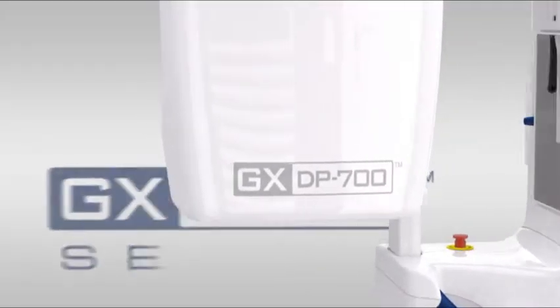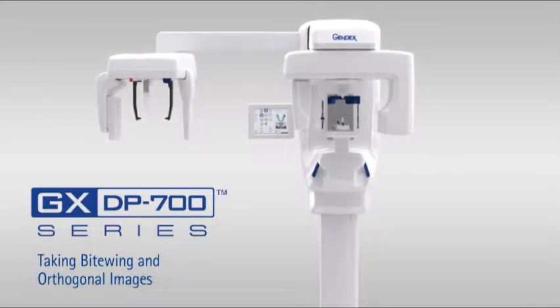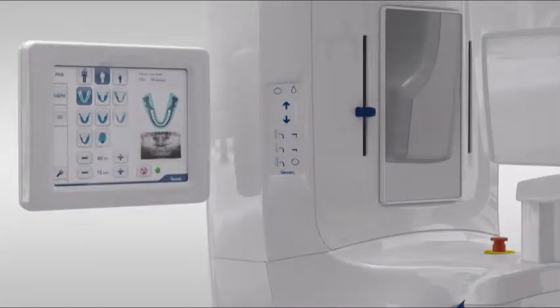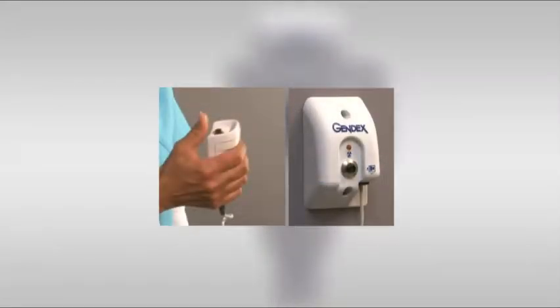Welcome to the GXDP-700 training video on positioning optimal bitewing and orthogonal images. It's important to familiarize yourself with the various parts of the system. Included are the rotating unit, column controls, touch screen, easy position items such as chin support and bite guide, head supports, hand grips, and positioning lasers. Finally, the exposure trigger, which either may be a handheld device or wall unit.